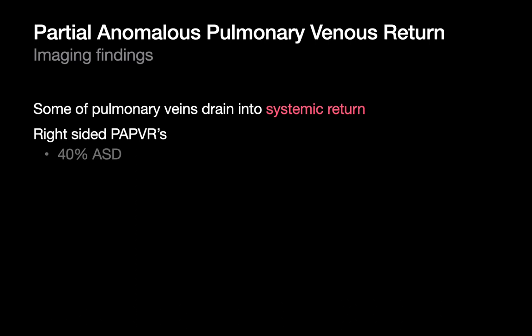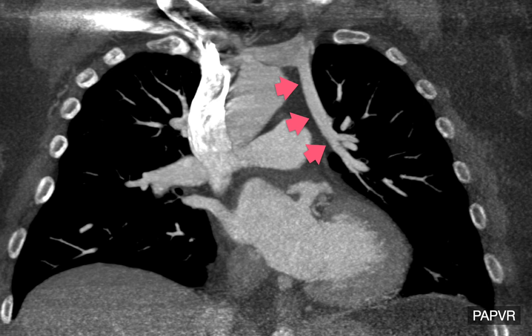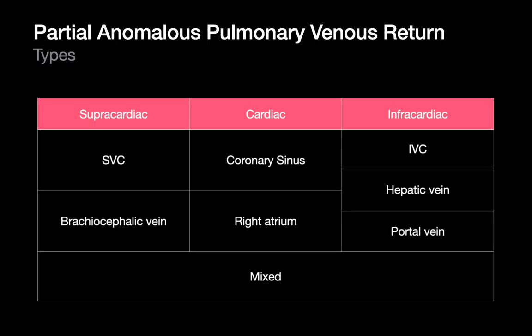PAPVR is the final central venous condition. In PAPVR, some of the pulmonary veins return to the heart via the systemic central veins and right atrium instead of the central pulmonary veins and left atrium. On this coronal MPR, you can see a conspicuous pulmonary vein draining the upper left lung into the left brachiocephalic vein instead of the left atrium. There are many different types of PAPVR, classified according to where they drain to — the SVC or central veins in the chest, the IVC or central veins in the abdomen, or directly to the right side of the heart. PAPVRs could occasionally exhibit mixed drainage.